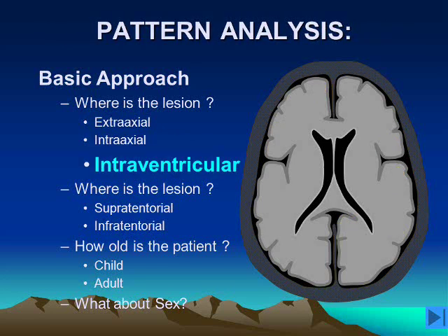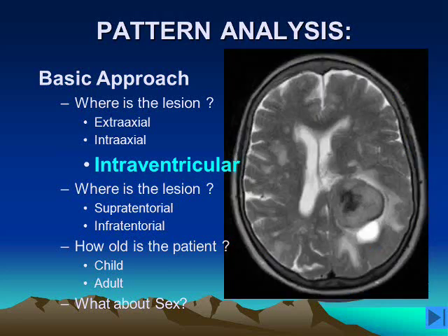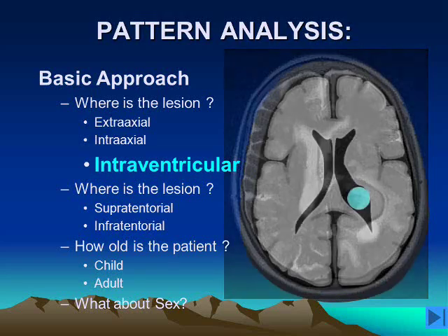A third location for intracranial lesions is within the cerebral ventricles. There are two lateral ventricles, a third and a fourth ventricle. Most commonly, intraventricular masses are seen within the lateral ventricle, and the most common location for a lateral ventricular mass is in the region called the atrium or trigone. These lesions are typically related to the choroid plexus, which is in this location. This is a patient that has an intraventricular meningioma — we can see how the lesion is located in the trigone of the patient's left lateral ventricle on the right side of the image.